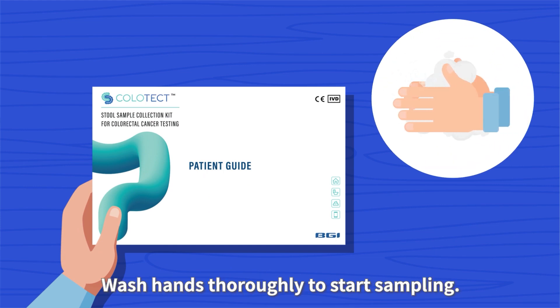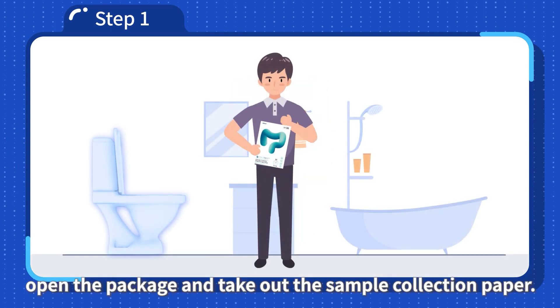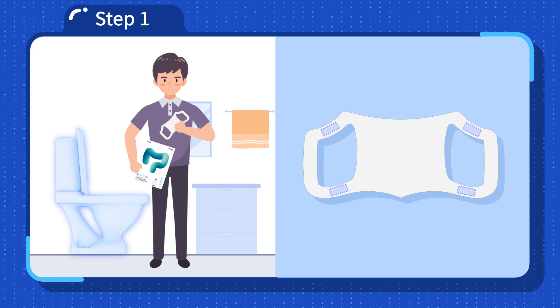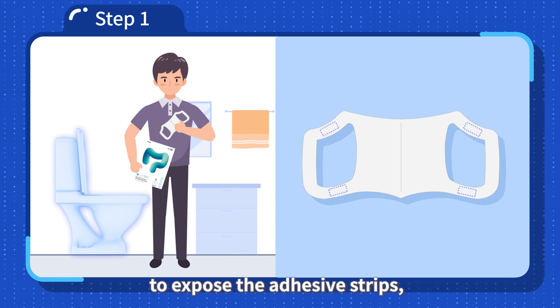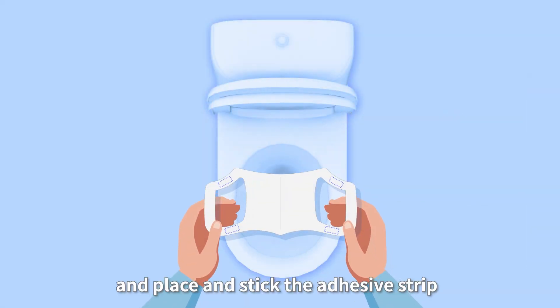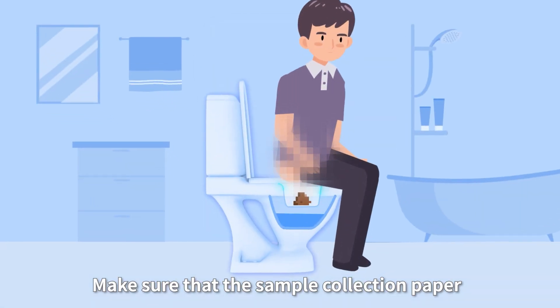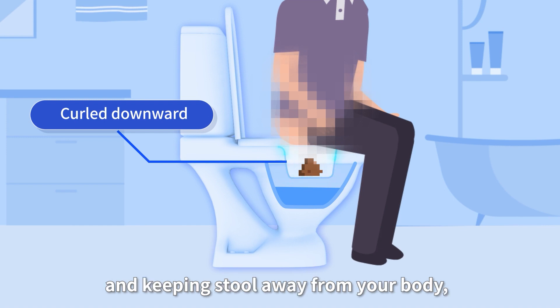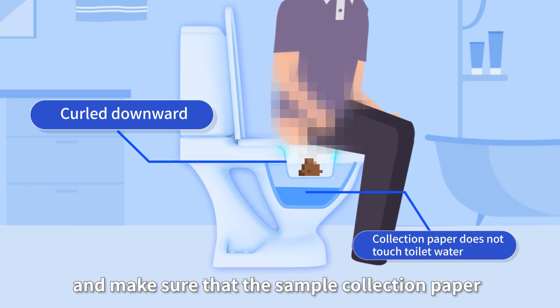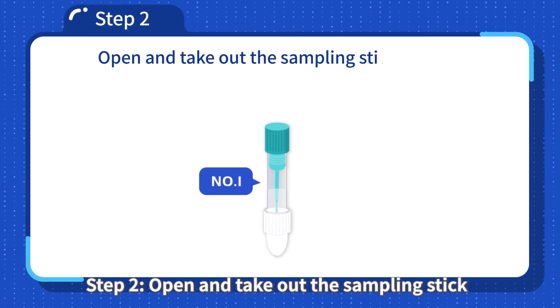Step 1: Raise the toilet lid and seat. Open the package and take out the sample collection paper. Peel off the protective films on the sample collection paper to expose the adhesive strips. Place and stick the adhesive strip of the sample collection paper over the toilet rim. Make sure the sample collection paper is curled downward, leaving enough space for collection and keeping stool away from your body, and make sure the sample collection paper does not touch the toilet water.